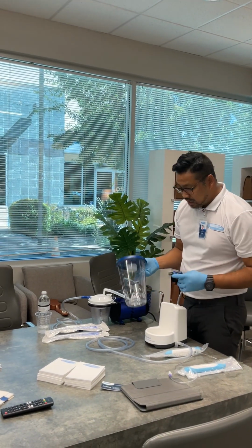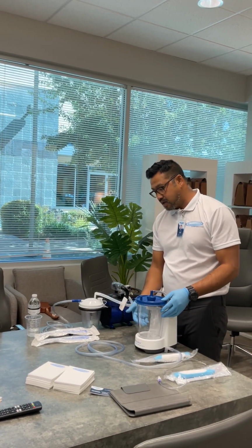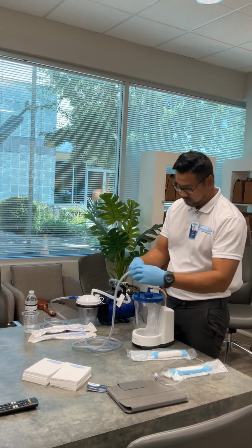Okay, and you just rinse it and put it back? Yeah. If you need another one, if for whatever reason it drops, cracks, or whatever, you just notify us and we'll be happy to drop one off.